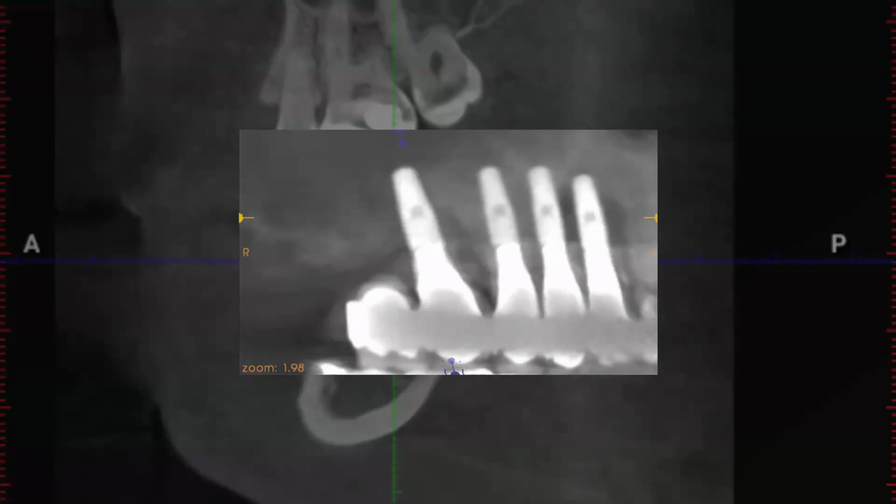If you haven't heard of sinus lifts, that's where they push the membrane up. So surgically, you drill into the bone. There are different ways to do it. The least invasive way is just to go through the implant hole. You can drill a hole into the implant site and gently push the sinus membrane up and then pack bone in the floor of the implant site. Or they used to go from the side a lot more. But the point is pack bone in there, let that bone heal. Probably the most ideal way to do it.